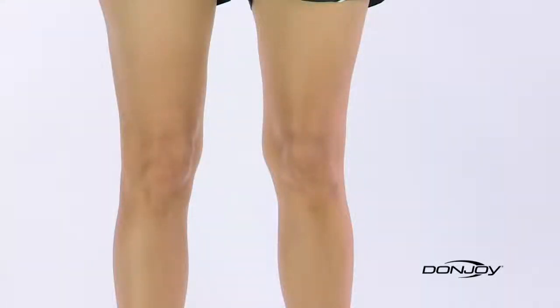To determine your DonJoy knee brace size, you'll need a tape measure to take three measurements: one at knee center, and then at your thigh and calf, six inches above and below your kneecap. The best way to do this is to stand with your legs shoulder-width apart, legs slightly bent with your muscles contracted.